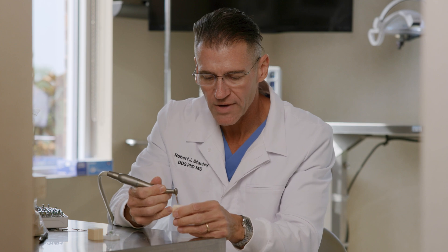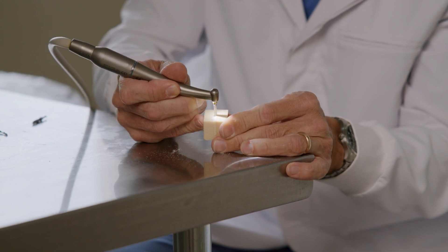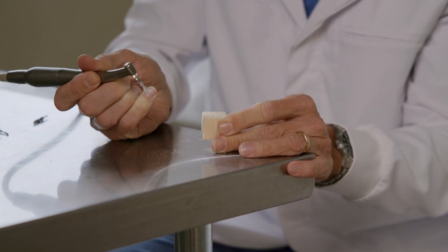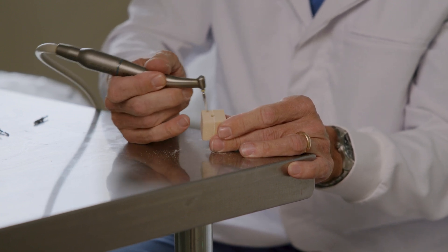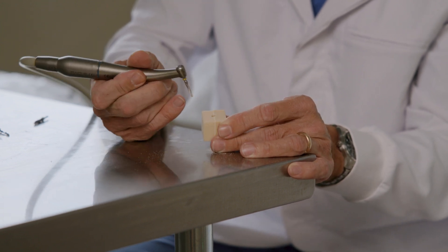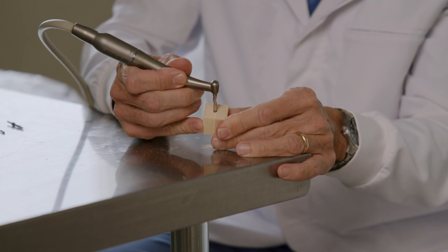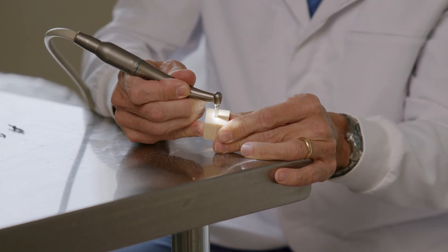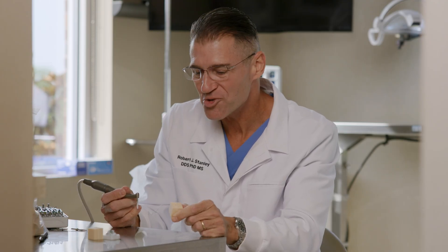We're going to our third drill now, trying once again to get a little bit better placement. It's wallowing around — a term we use in the South meaning it's not staying on target and moving around, making the hole considerably larger than the drill I'm actually using. No matter what I do, it doesn't want to go into the dense foam; it just wants to go into the soft foam. For the last drill, we try again to push into the dense bone, but it's nowhere near the center. No matter what I tried, it's just really terrible.